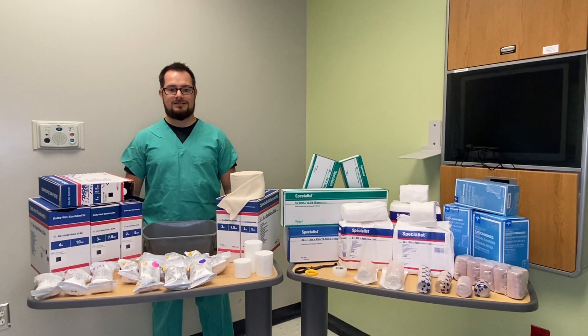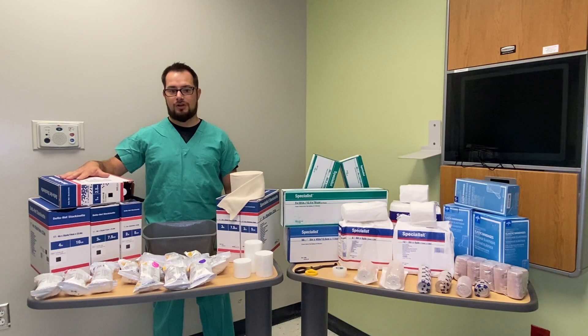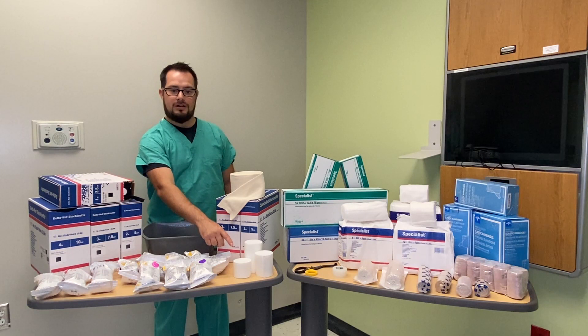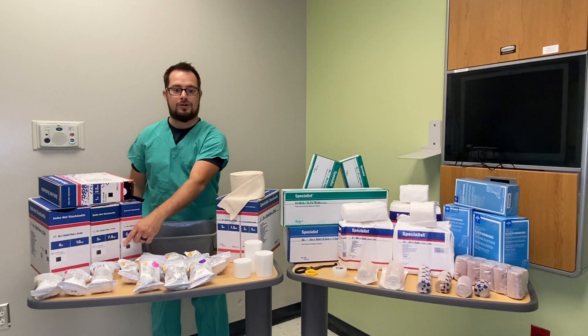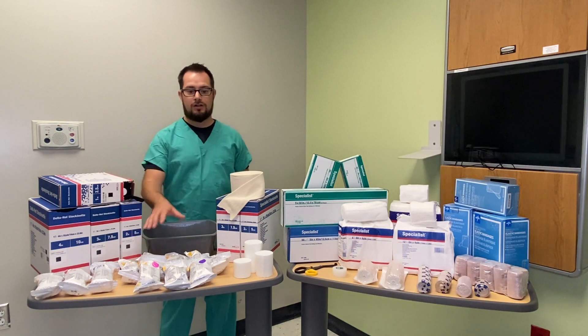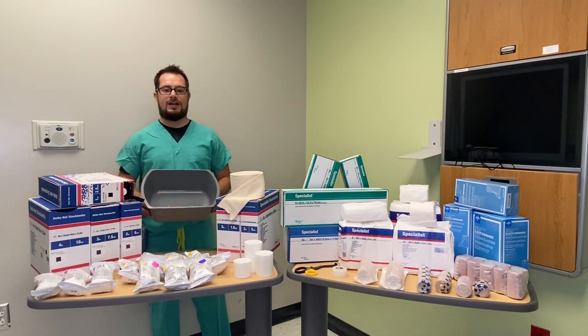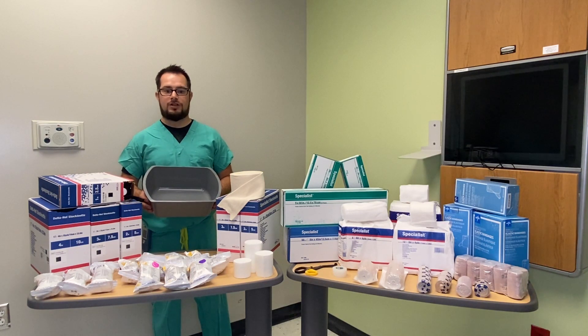For our fiberglass cast, we have one inch, two inch, three inch, and four inch in color black stockinette. For our cotton, we have two, three, and four inches. For our white fiberglass, we have two, three, and four inch, and then we have eight different colors to choose from. In the clinics, you may have other colors available. You'll need a receptacle such as a wash basin. For plaster of Paris, use warm water with a temperature ranging from 70 to 75 degrees. For fiberglass cast, use cold water.